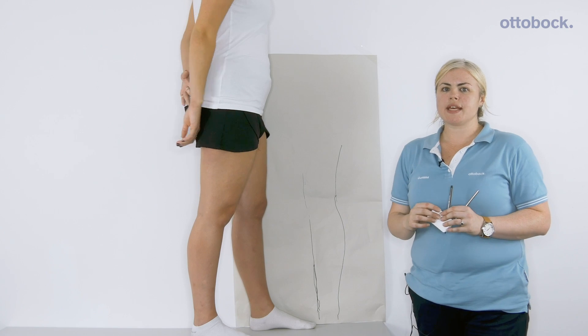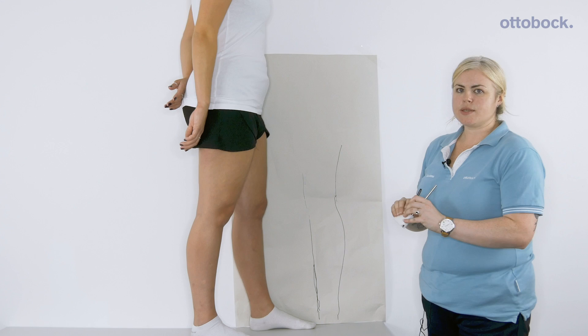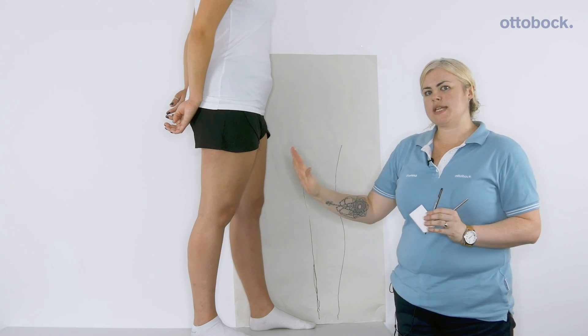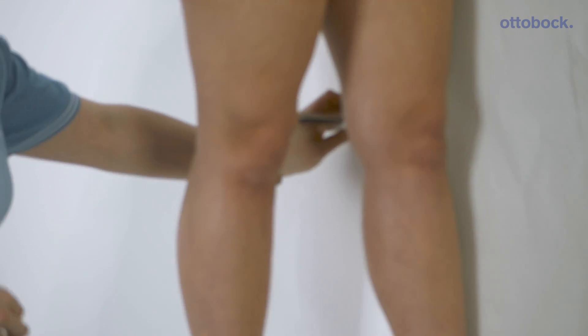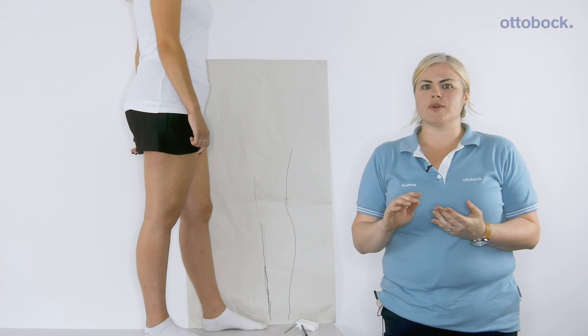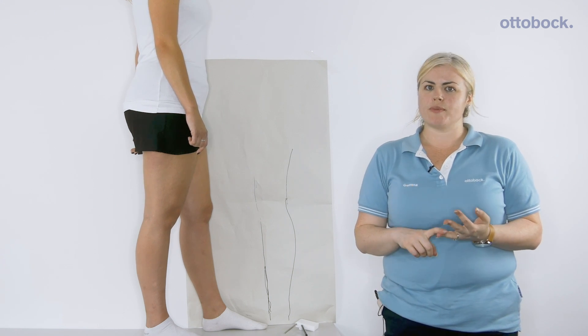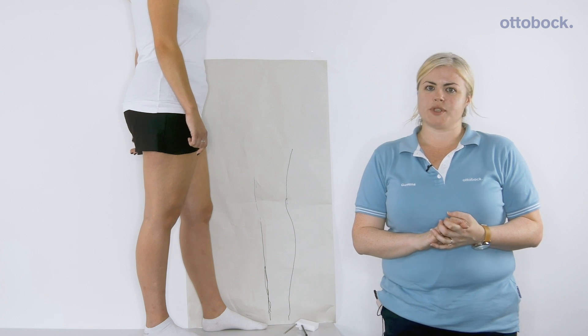You'll then need to take a sagittal plane draft, ideally leg against the wall, ensuring the knee isn't locked out or flexed. There are quite specific prescription guidelines for the Free Walk with the full measurements, including the tibial angles, which are available on the measurement chart.